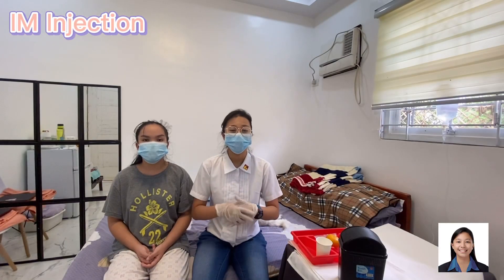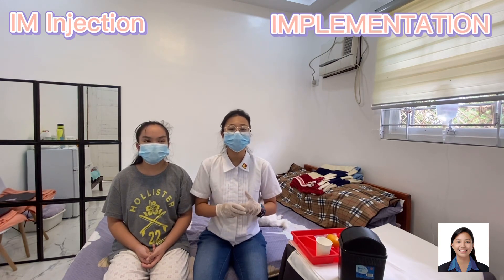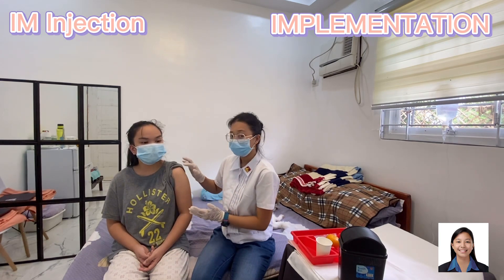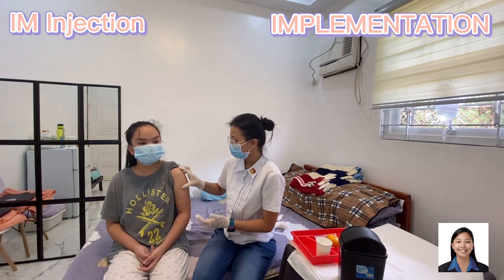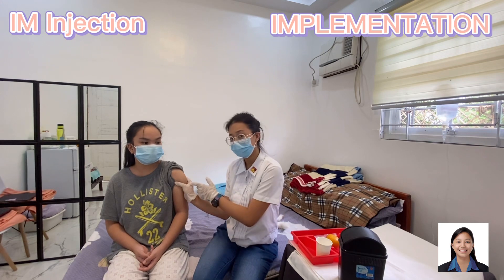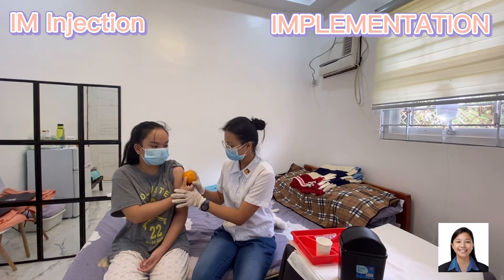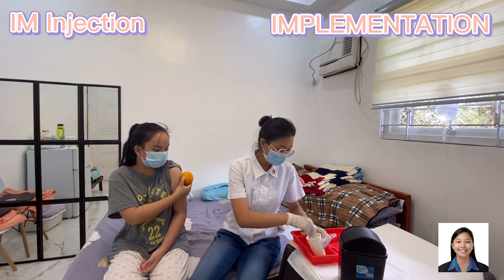Lastly, I will be demonstrating how to perform an intramuscular injection. In doing intramuscular injection, we'll choose the deltoid site. To locate the deltoid, identify the acromion process at the end of the clavicle and the axilla — the deltoid is just here. After locating the site, cleanse the area with alcohol in a circular motion, starting from the center going outwards.